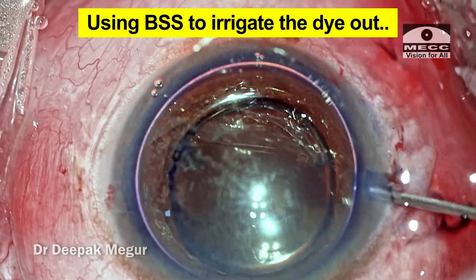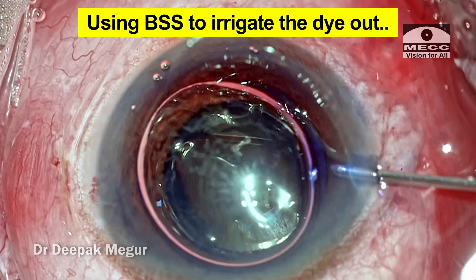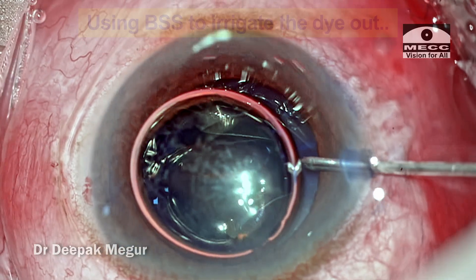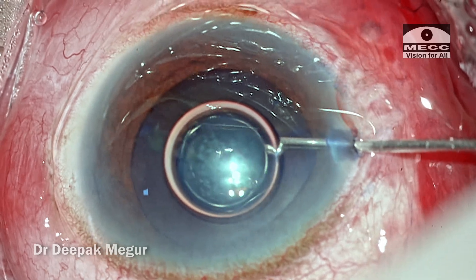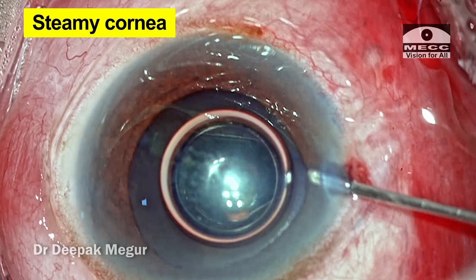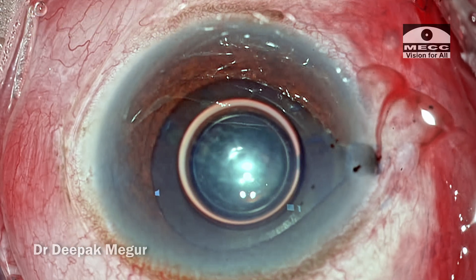To irrigate the dye out, he is using the BSS. At this stage, you can see the amount of pressure which is developing inside the anterior chamber — the cornea becomes a little bit steamy, and there is an iris prolapse at the wound.